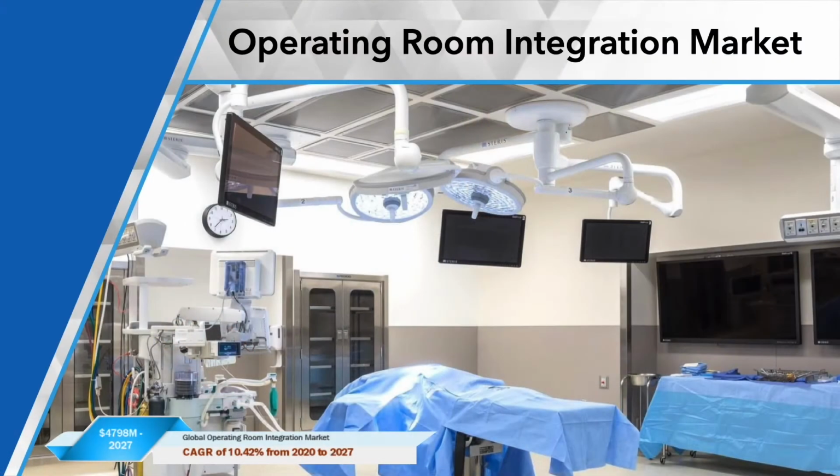So everything that's draped in blue there is supposed to be sterile. So any display that's over a patient cannot be vented or does not need to have fans, because the moment you have those, then you end up contaminating the sterile field.